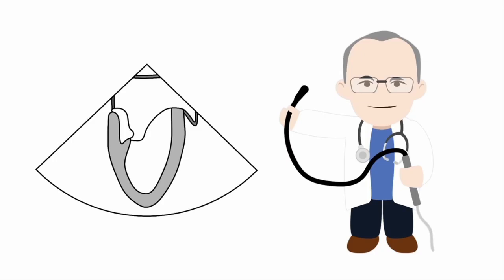In this lesson we're going to learn specifically how to assess the left atrial appendage on transesophageal echo. We're going to begin with the mid-esophageal two-chamber view with the left atrium, the mitral valve and left ventricle, and you can just see the left atrial appendage at the edge of the screen here.